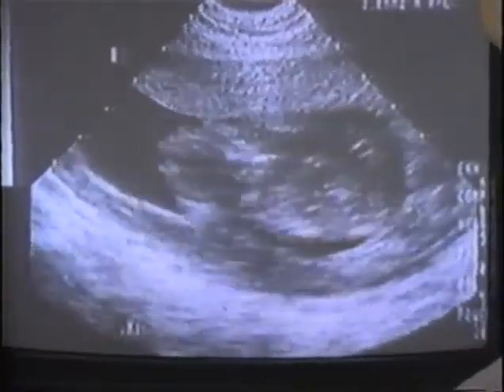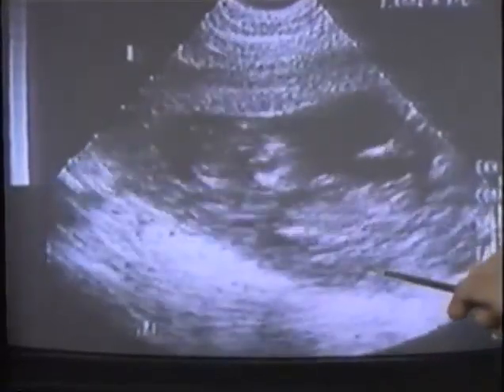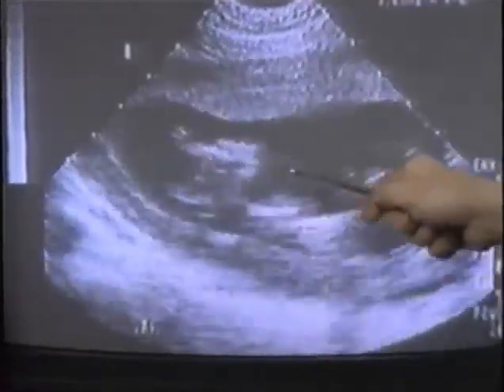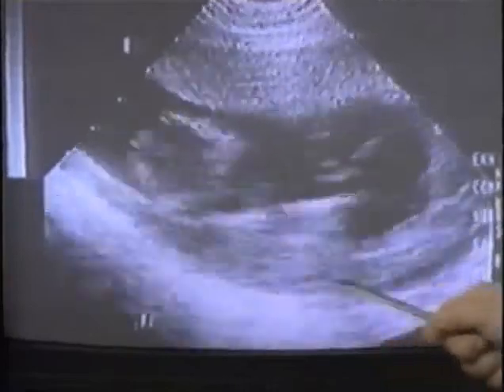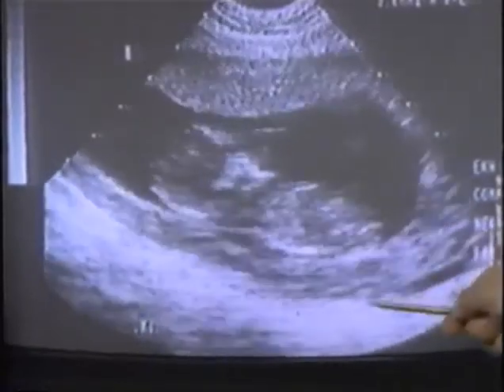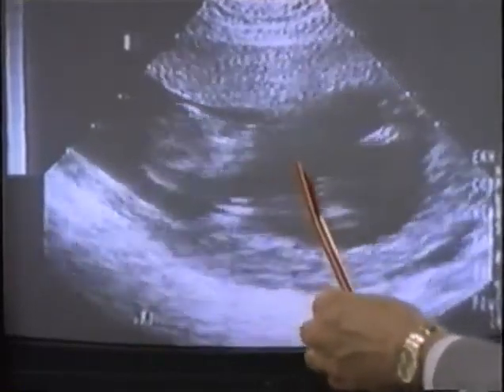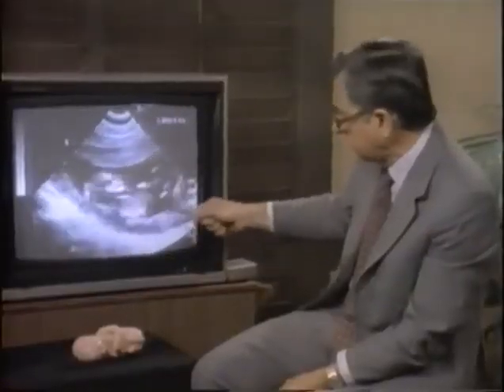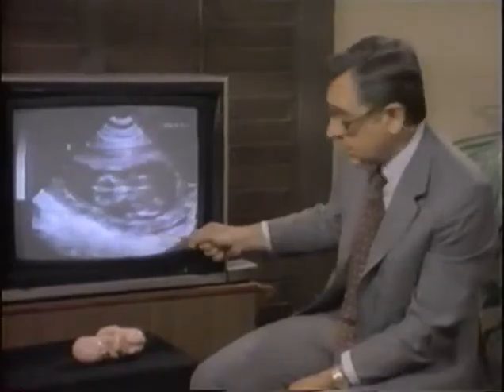a violent manner. The child has now moved back to the profile view, and the suction tip is flashing once again across the screen. The child's mouth is now open, and we will see that again on a freeze frame in a moment. But this suction tip, which you can see moving violently back and forth on the bottom of the screen, is the lethal instrument which will ultimately tear apart and destroy the child. It is only after the fluid has been broken, the sac has been disrupted, that the tip will actually come against the child. But we can see the tip moving back and forth as the abortionist seeks the child's body.